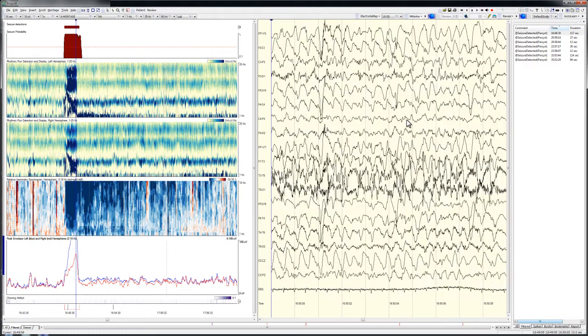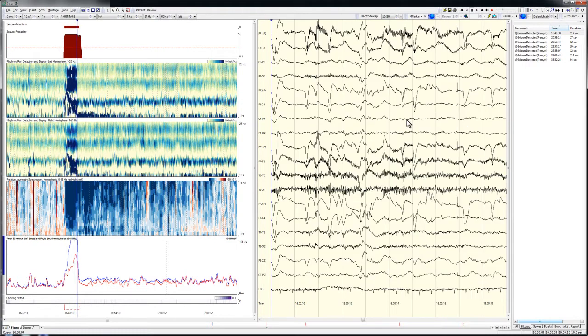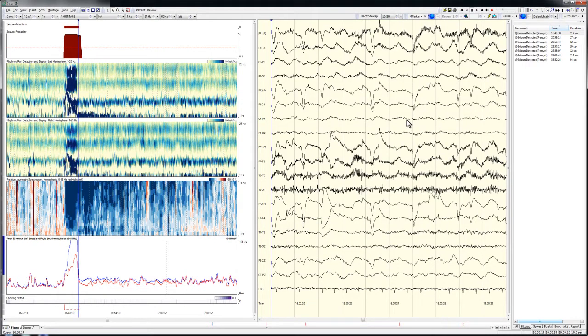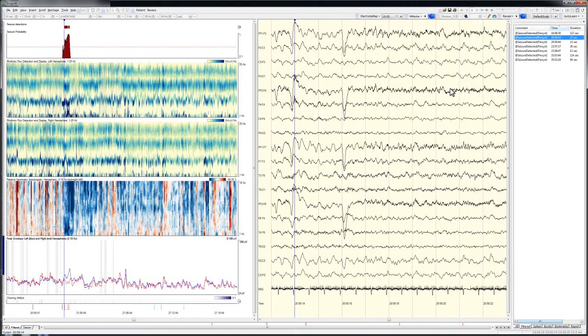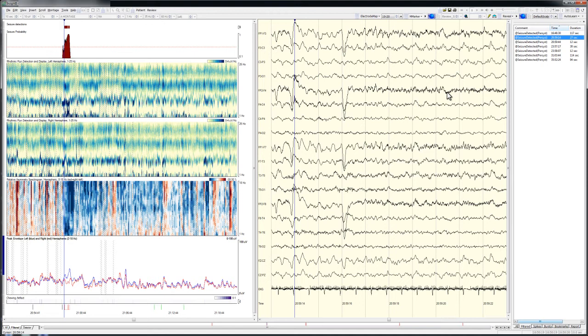Clicking on the next detection brings us to a new seizure which shows a somewhat different pattern on the EEG trending graphs. The trending graphs suggest this seizure is more confined to the left hemisphere than was the last, and that the amplitude increase during the seizure is not as great as had been present in the prior event.